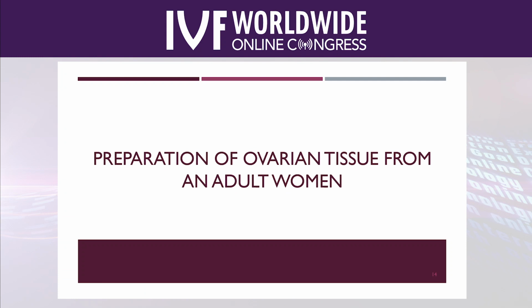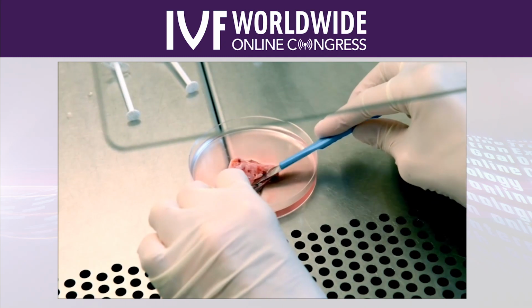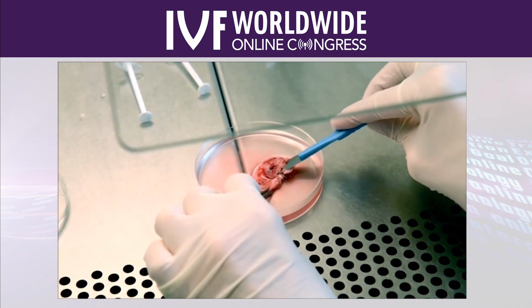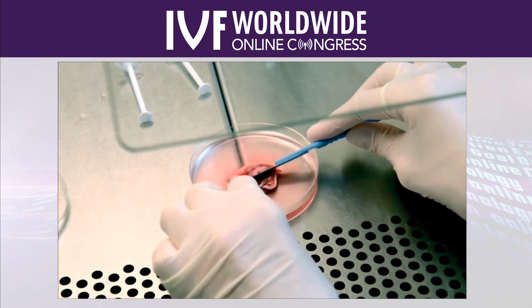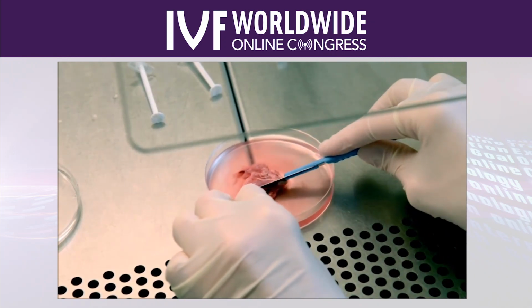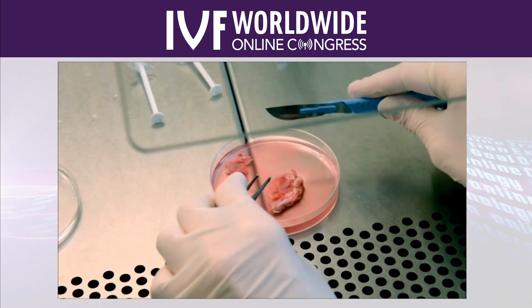So this first video will show you how we prepare an adult ovary. And here you can see there's this thick medullary part that we need to remove to get to the cortex, and it's quite vascularized, which is giving it this red-pink color. So in the beginning, you would just try and cut away all of this medulla, and you can see the cutting technique here is that you're cutting into the tissue and then you're leveling off before you go into the cortex. And then we just cut away small pieces, and this procedure normally takes around 15 minutes.